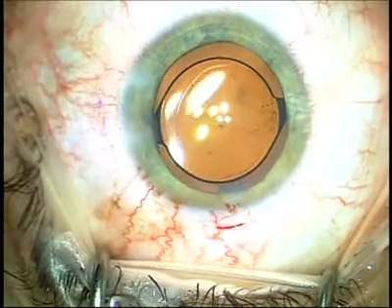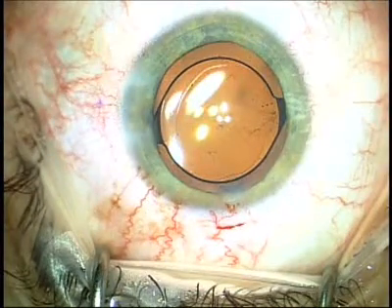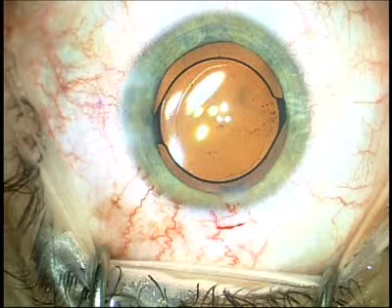You can also see how much detail there is present in the edge of the IOL, the edge of the capsulotomy, and the overall clarity. One of the things that's quite remarkable when you use a Helon and Helon 5 technique is how optically clear the anterior chamber is immediately after the surgery and on the first day post-op.